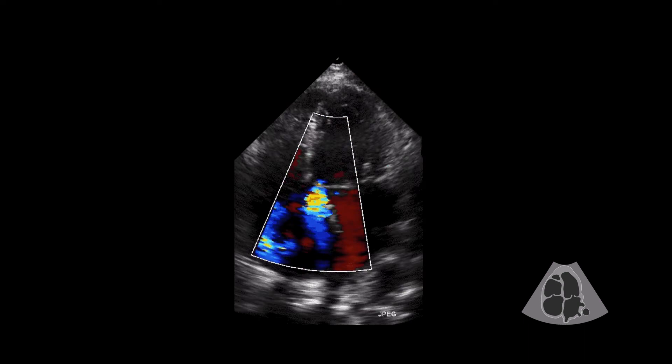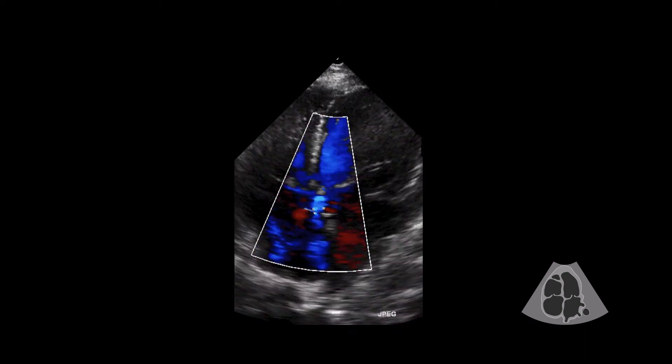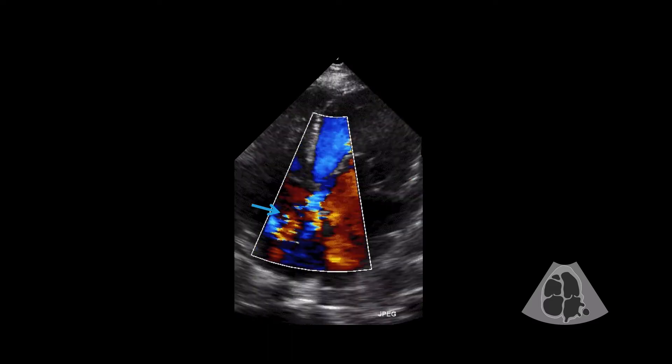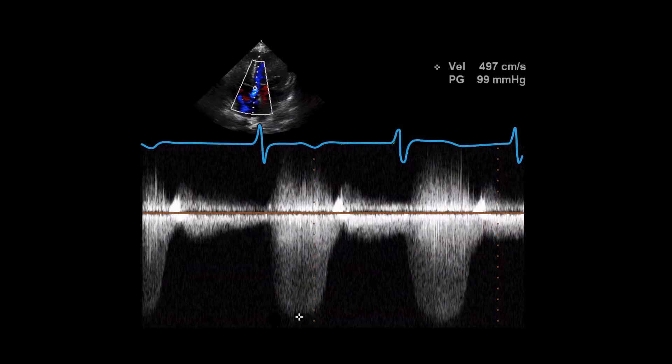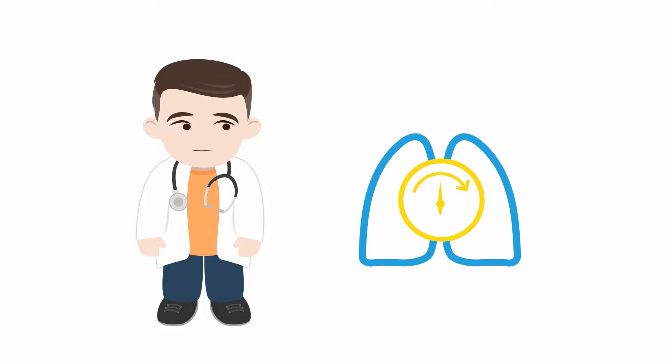But sometimes the jets can get very tricky. Here is a patient post-repair with a jet entering the right atrium. If this is tricuspid regurgitation, then it suggests significant pulmonary hypertension. If this is not tricuspid regurgitation, then what is it? Where does it come from? And is it bad?